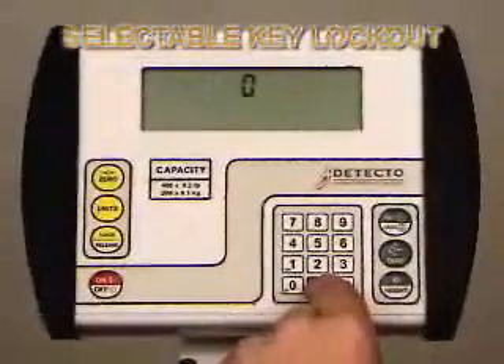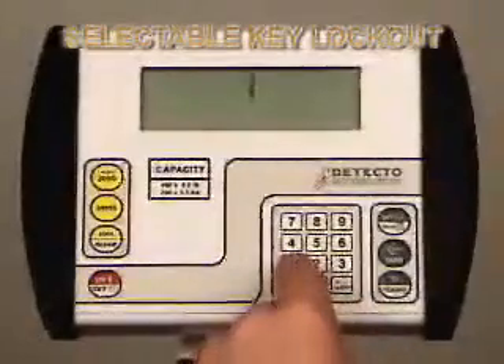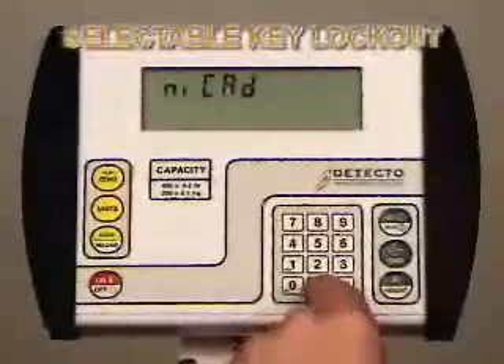Press Enter once to show the current value. If the value displayed is acceptable, press the Enter key to save it. Otherwise, use the numeric keys to enter a new value, then press the Enter key to save it.